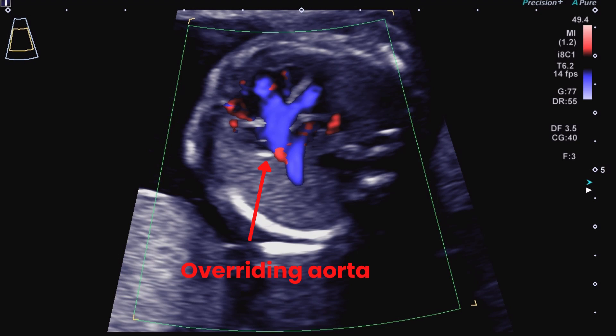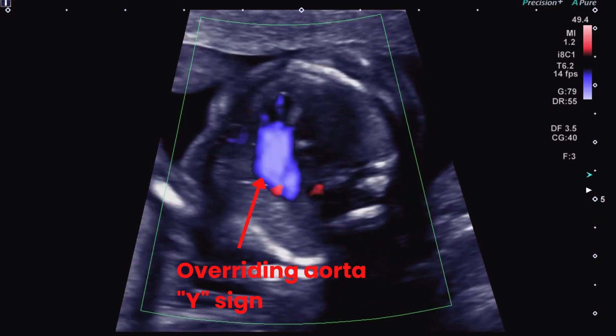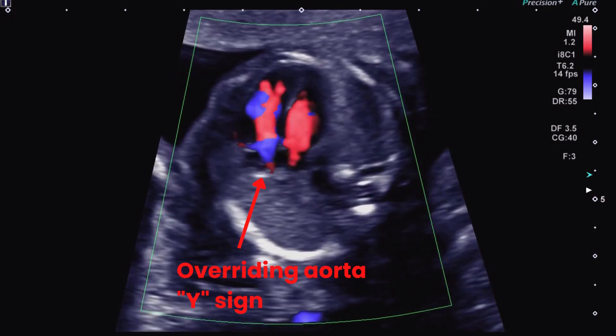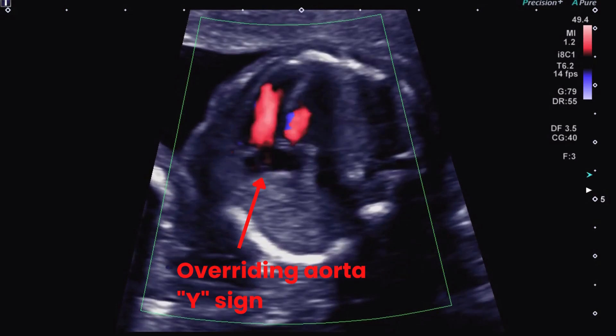This is the overriding aorta, often described as the Y sign. The right ventricular outflow obstruction combined with the ventricular septal defect results in increased aortic outflow. Thus, the aorta appears dilated on ultrasound.